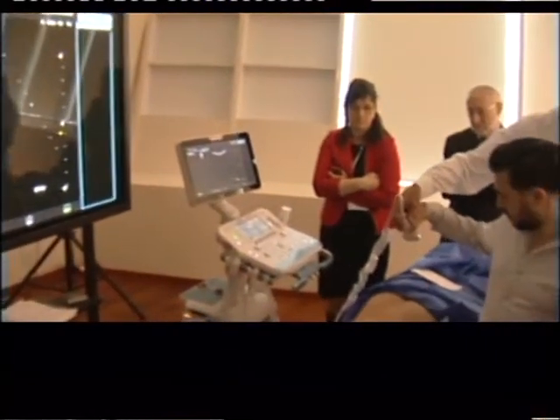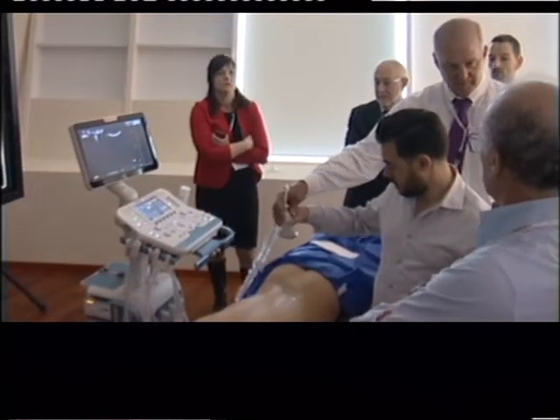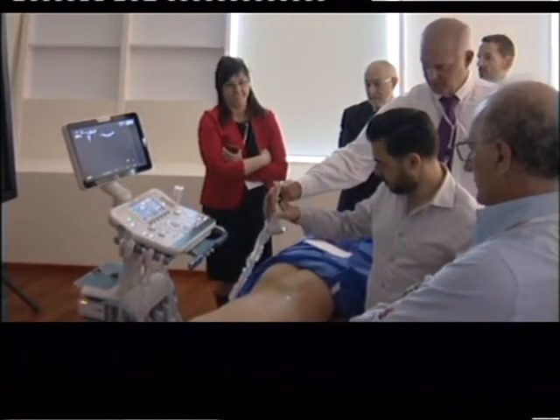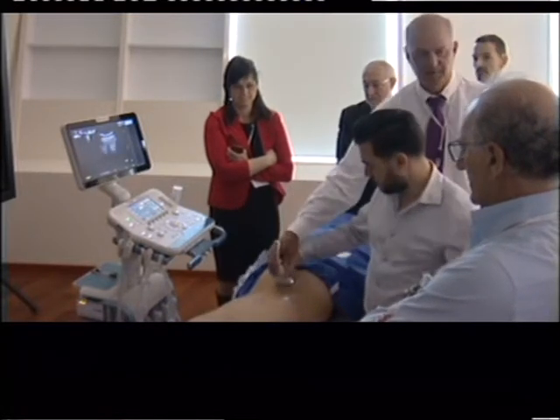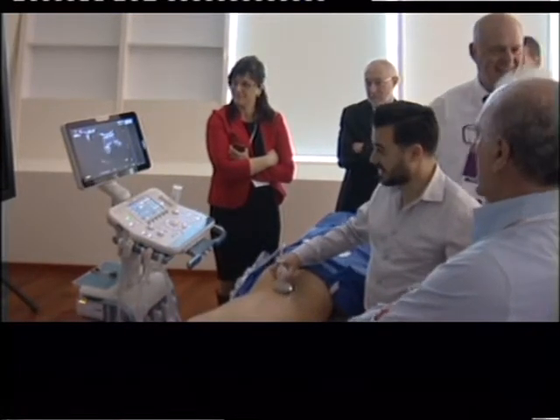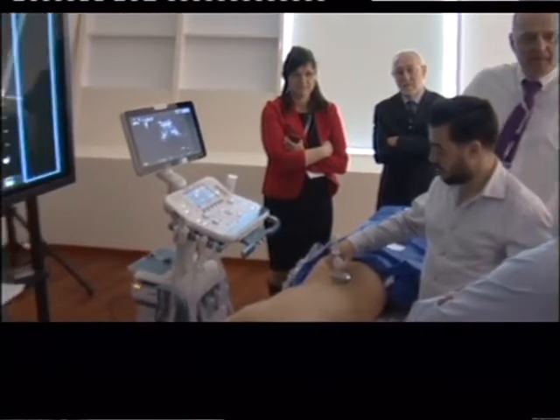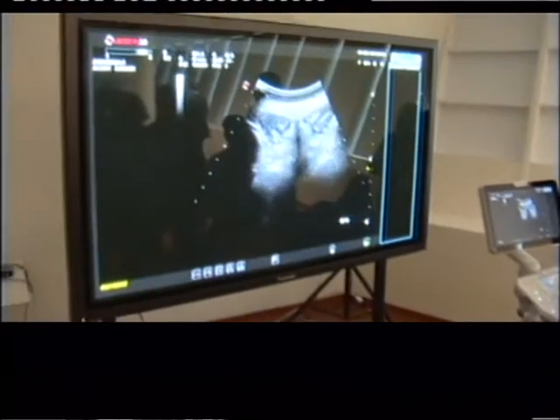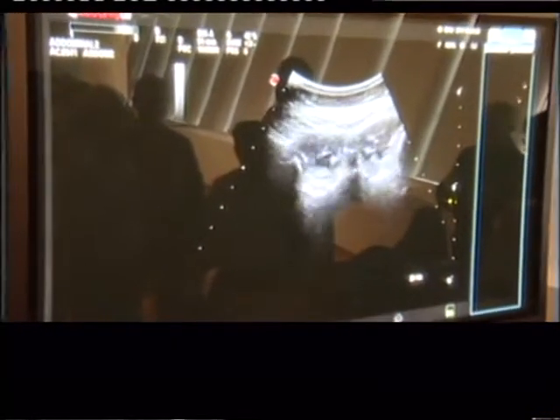So look, paintbrush. See? Not this. This. Okay, so 3, 4, 5. Like a paintbrush. More. There you go. Like a paintbrush. One can study the angulation of the single lumbar vertebra from a previous longitudinal scansion.